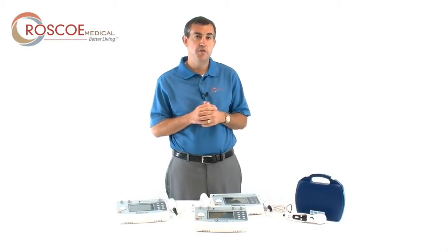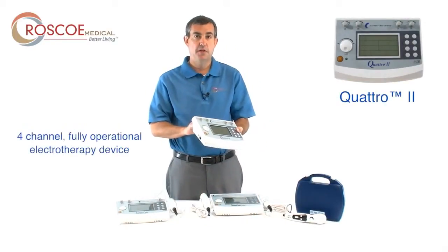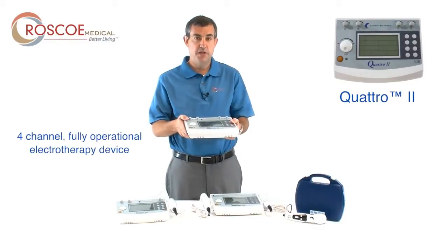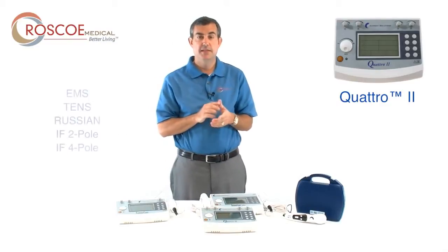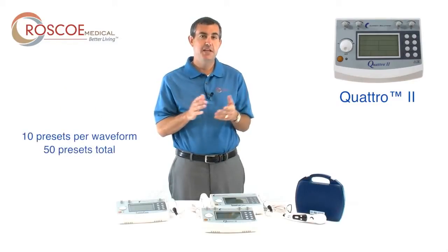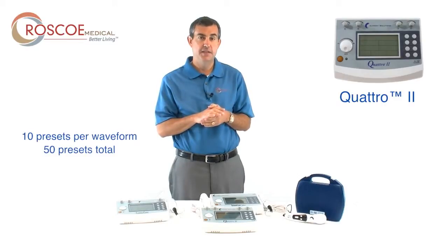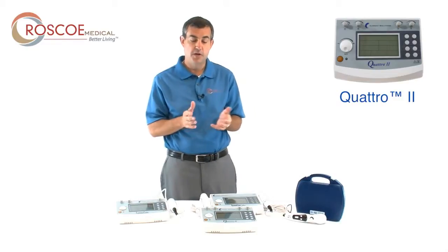Let me start off with the first one called the Quattro 2. The Quattro 2 is a four-channel fully operational electrotherapy device. This device has EMS, TENS, Russian, IF2 pole, and IF4 pole. There are 10 presets per waveform, making a total of 50 presets. But also, in addition to presets, you can actually use your own protocols for every single waveform, making the Quattro 2 very unique.